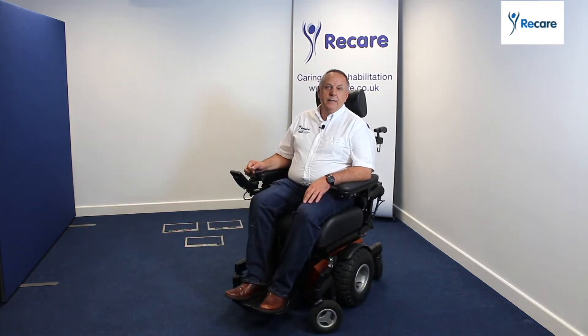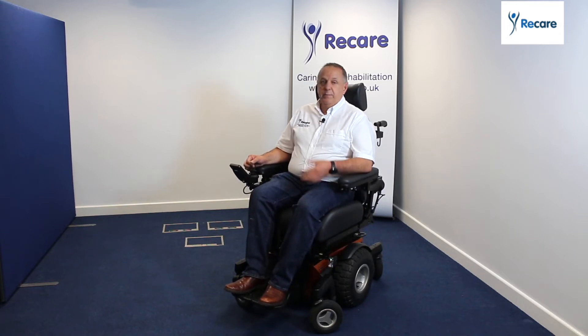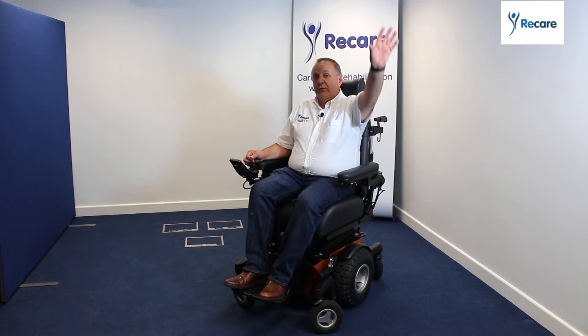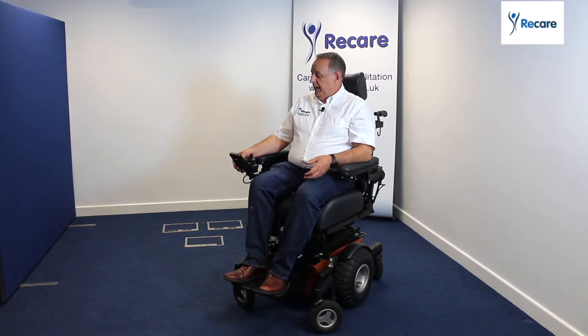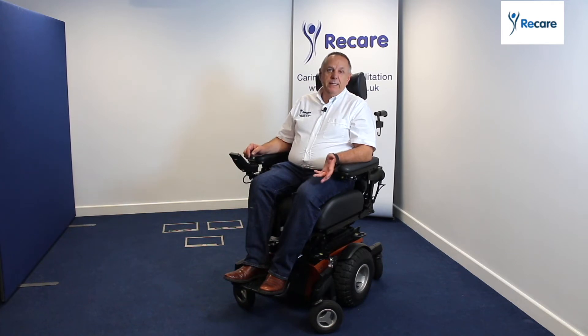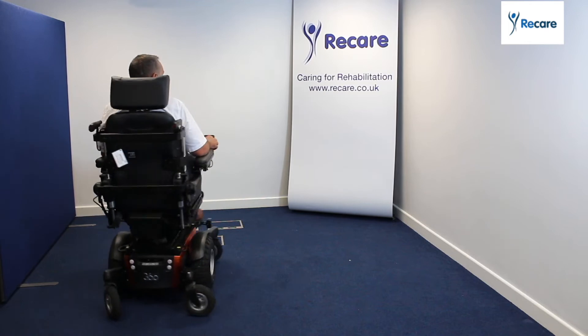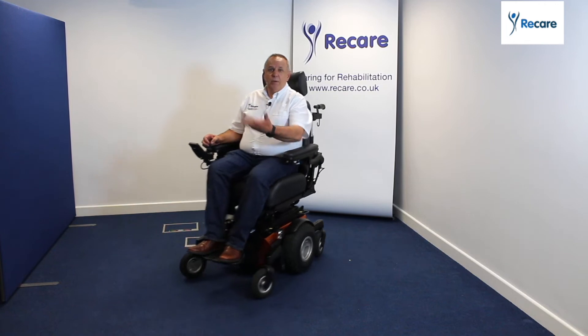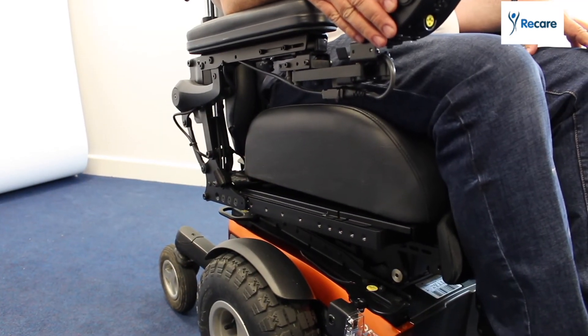The lift is a good function — what it allows you to do is be interactive with people, give you that inclusion, and also allows you to reach for things so you can be more independent. But more importantly, what this chair has is a thing called See Me Technology. What that allows me to do — if you notice I'm in lift but I'm still driving — and because of the high technology in the suspension in the base, I'm not rocking backwards and forwards; it's holding me in place nicely.